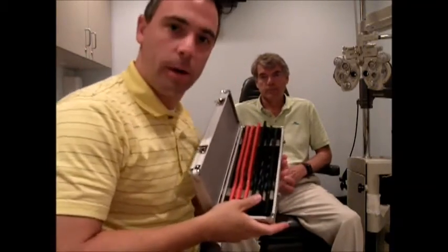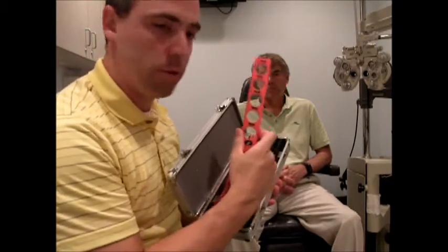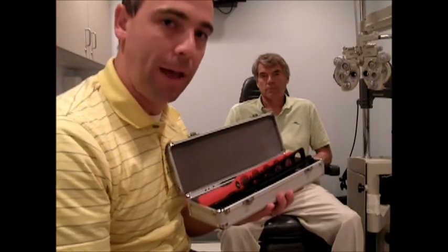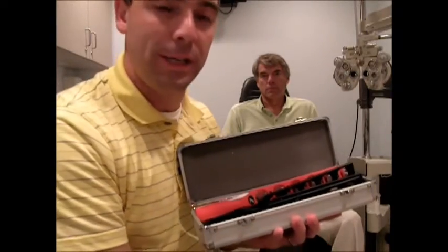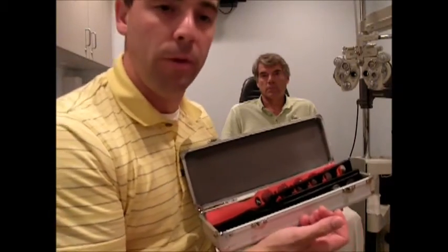Now I'm going to demonstrate how to do a manual lens rack refraction. This is a lens rack. There are different lens powers within these racks and the number right below each lens tells you the power. The farther the power is from zero, or the larger the number, the greater the lens power for that patient. These powers are measured in diopters.